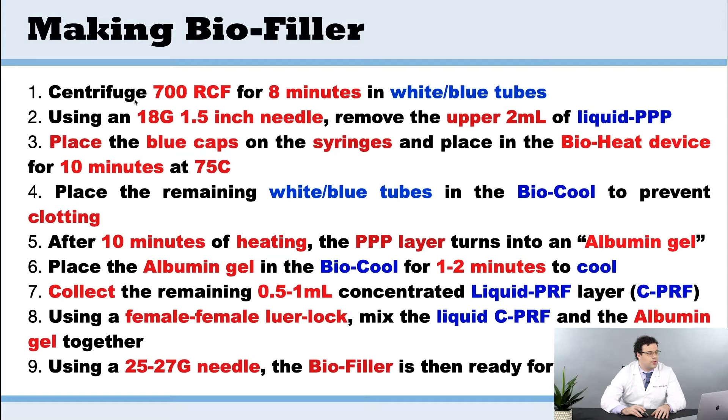The first thing we're going to do is centrifuge at 700 RCF for 8 minutes in the white tubes only — no red tubes here. Then we're going to take out the upper layer with an 18 gauge needle and remove roughly 2 mLs of the liquid PPP.